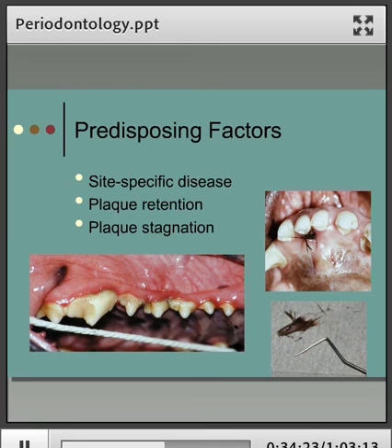In the other photograph, you'll see that we've got an area that does appear to be more inflamed. You can see the mucogingival line running along from premolar area to the molar, and in one area between two premolars we've got that area that's more erythematous, and the erythema seems to meet the mucogingival line, and the gingival margin sort of dips down.